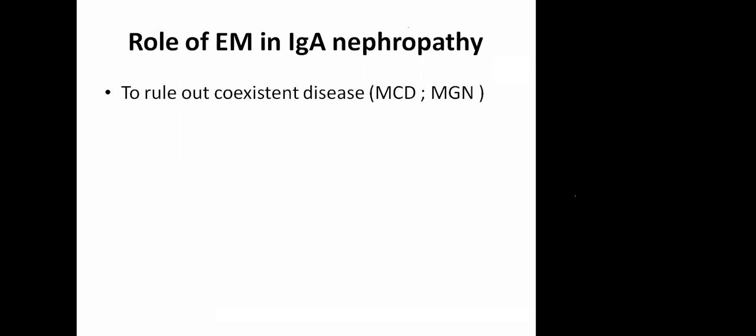But the problem is that with this kind of IgA nephropathy with minimal mesangial hypercellularity, no tubular ischemic chronicity, no glomerular sclerosis, it is not possible to explain such massive proteinuria. So if we do electron microscopy and find diffuse podocytic foot process effacement, then this finding suggests that there is a coexistent minimal change disease or primary podocytopathy in this case.